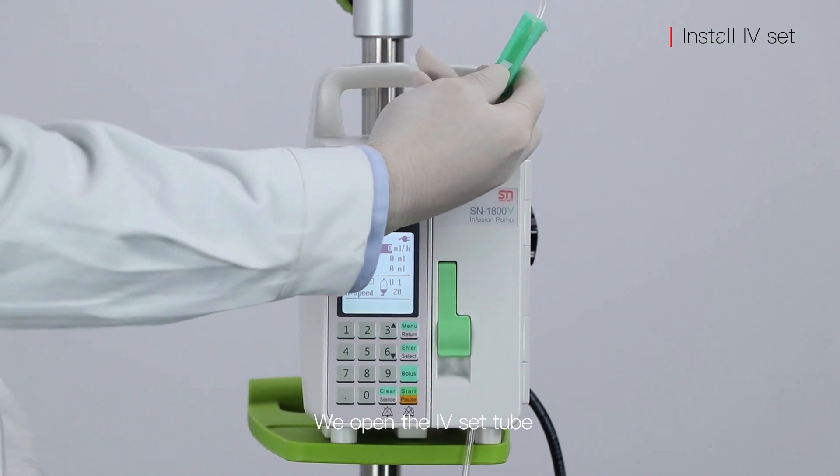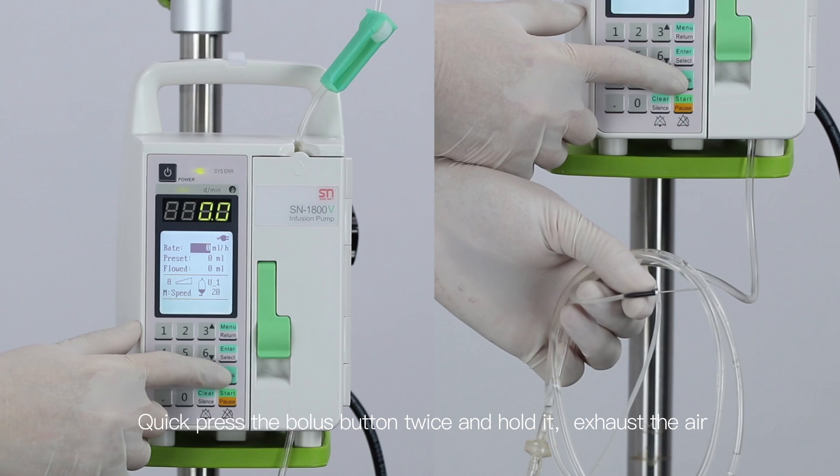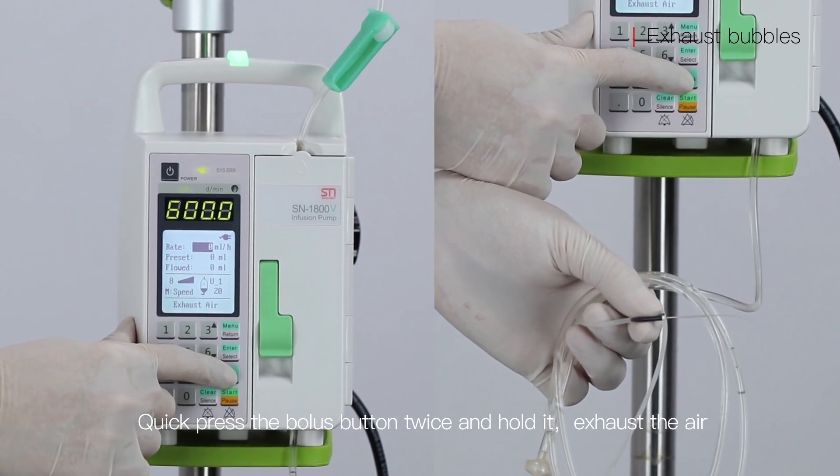Open the IV set tube. Quick-press the bolus button twice and hold it to exhaust the air.